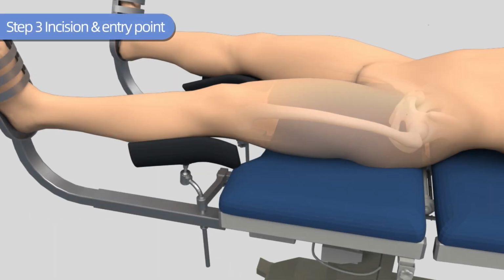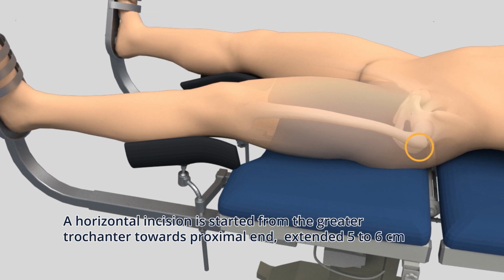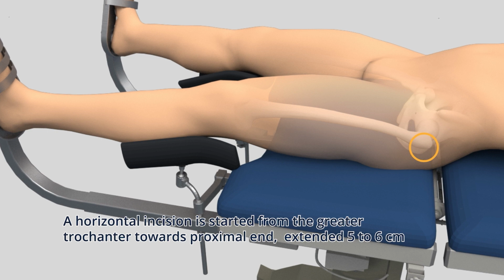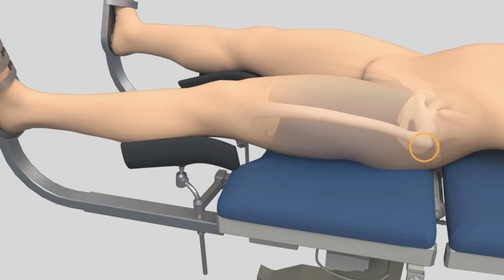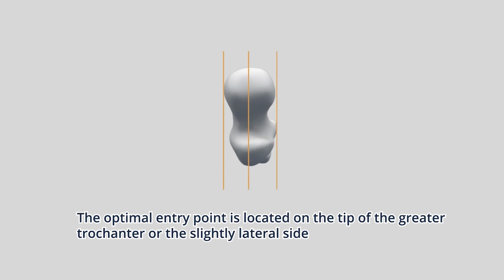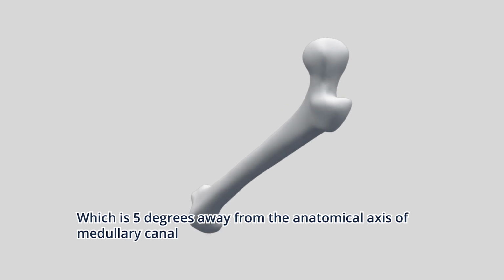Step 3. Incision and entry point. A horizontal incision is started from the greater trochanter towards the proximal end, extended 5 to 6 centimeters. The optimal entry point is located on the tip of the greater trochanter, or the slightly lateral side, which is 5 degrees away from the anatomical axis of medullary canal.